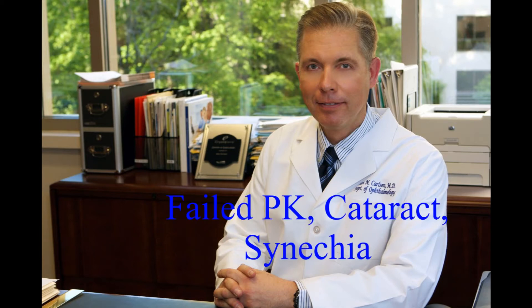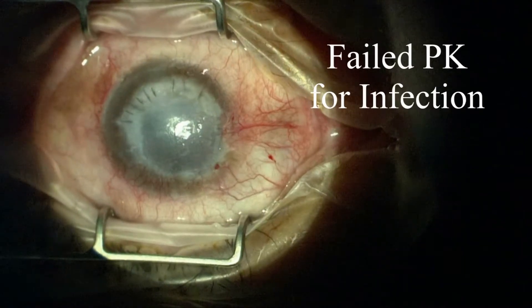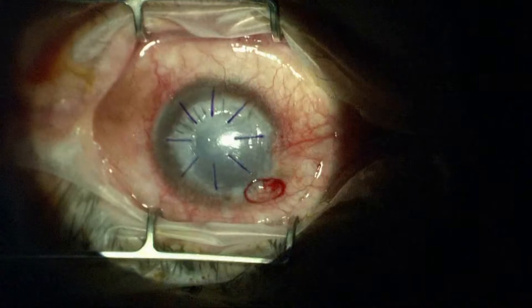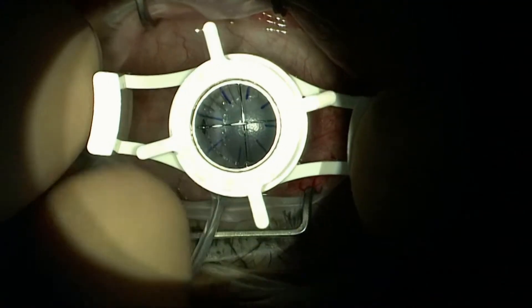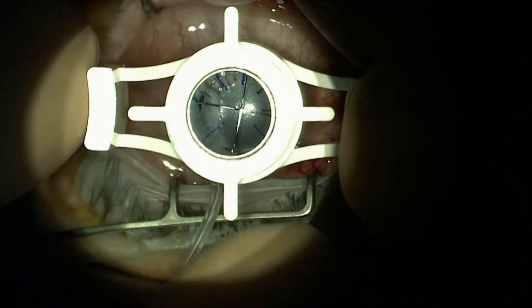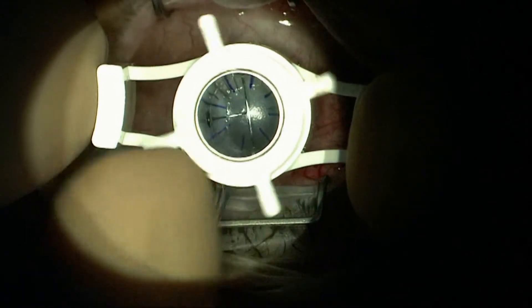Starting 2014 with a complex failed corneal transplant done previously for a severe infection that caused the eye to perforate. This had a very poor prognosis — as you can see, this transplant has failed, so I'm offering a repeat procedure.